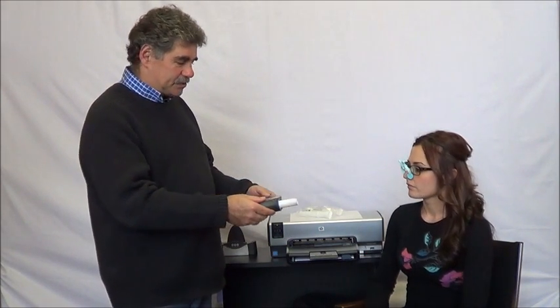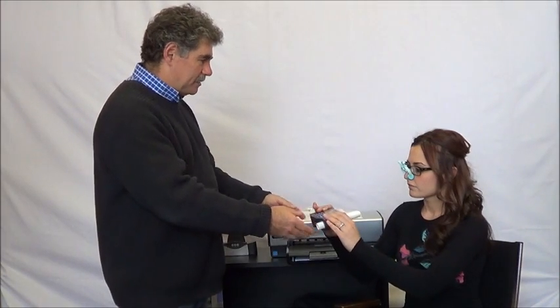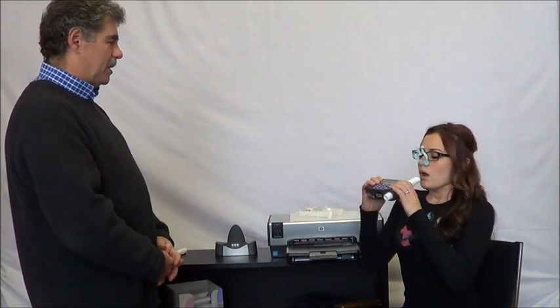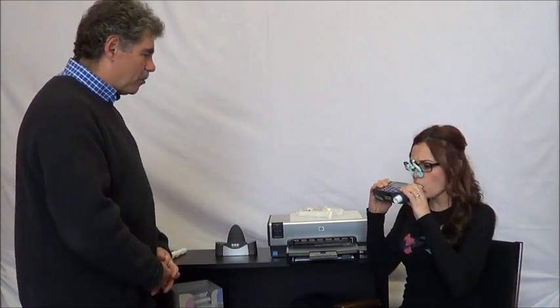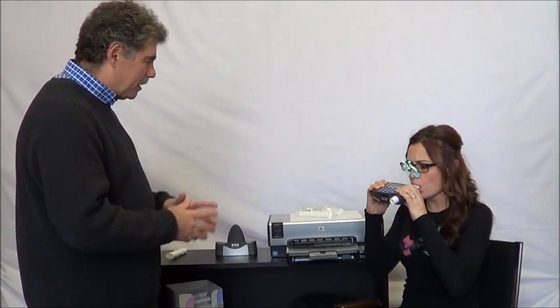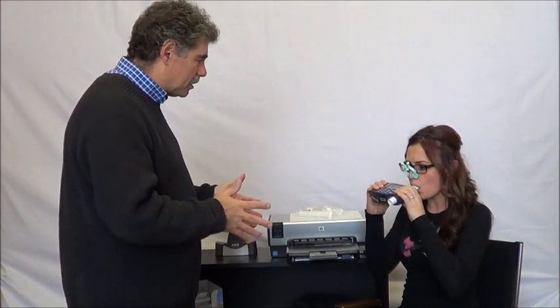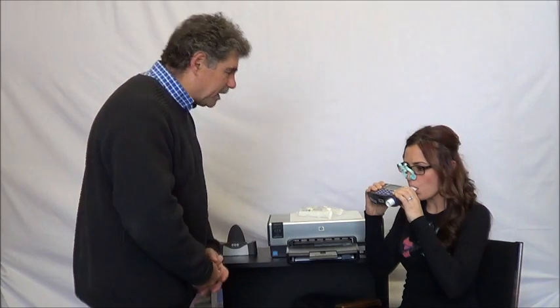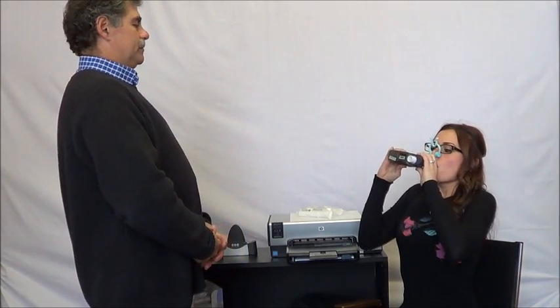It says 'blast out,' so we're ready to go. Blow — keep going, keep going, go, go, go. Big inhale. Very good.